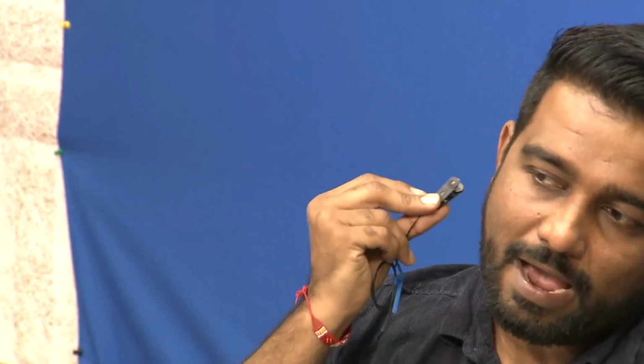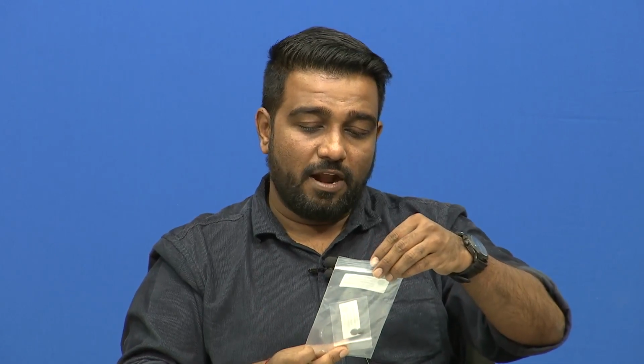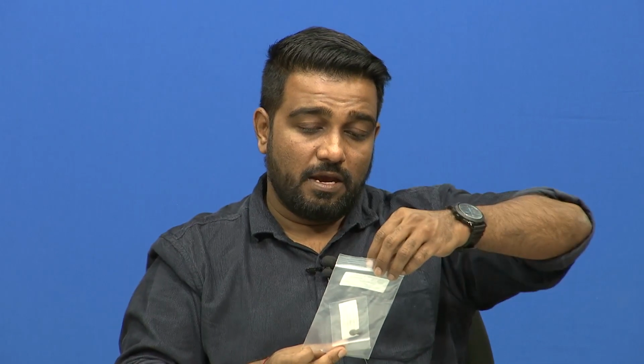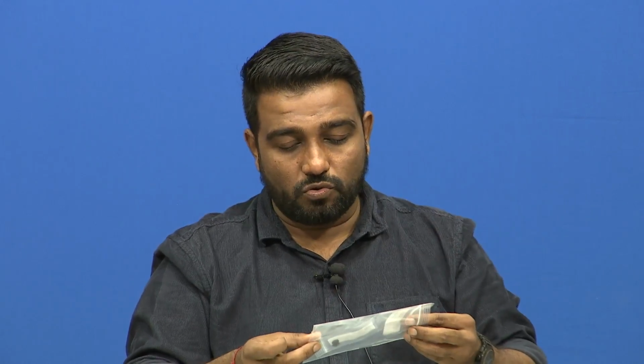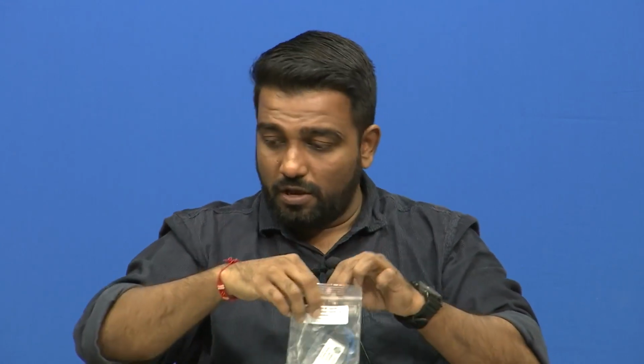I connect it to my ear like this. These are ear electrodes, and it is very simple. This is from OpenBCI, Florida Research Instruments, number TDE4312, and it is called an ear clip. This is another electrode that people use.